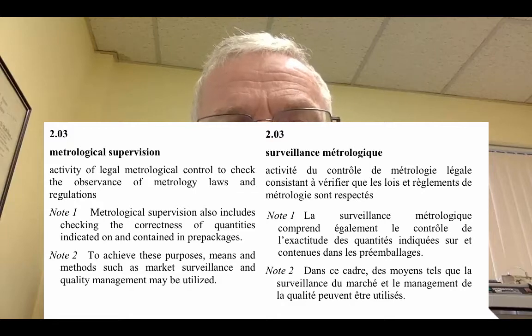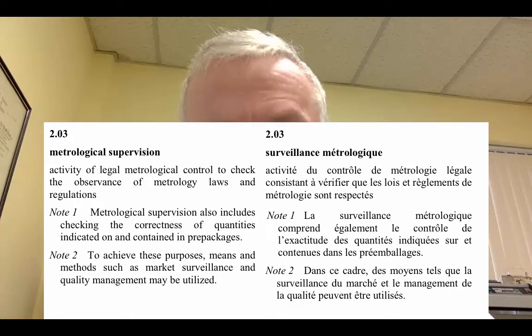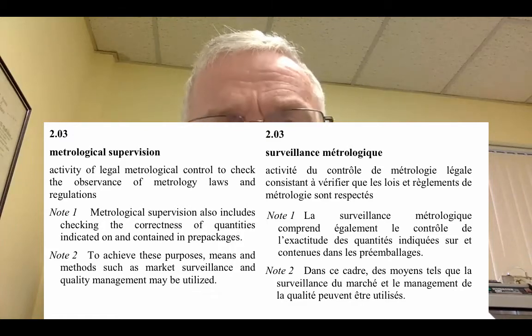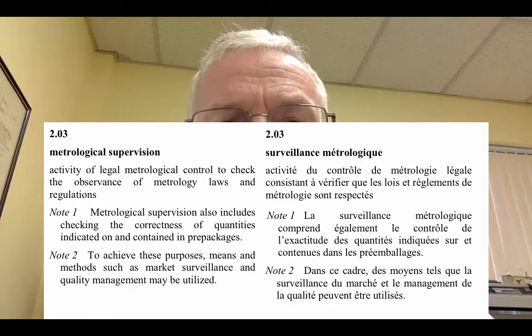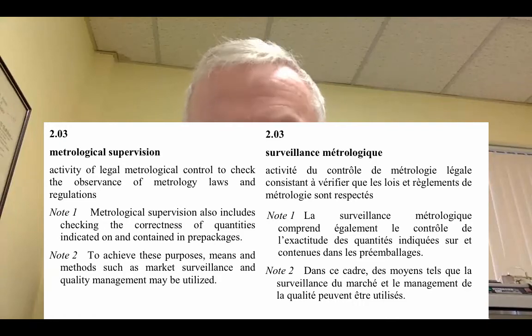And that's the crux of the problem for those of us who work on a day-to-day basis in the court system. How do we know if an instrument in the field, if it's not one of the originals that was evaluated for the Alcohol Test Committee, if it's 5 or 6 or 7 years later, and especially if there is no certificate of calibration from the manufacturer disclosed, or no documents disclosed or produced with respect to maintenance of the instrument, and particularly no documents disclosed with respect to control tests at values other than 100 milligrams per 100 mils. If we don't have that information, then we don't know that the instrument is calibrated.